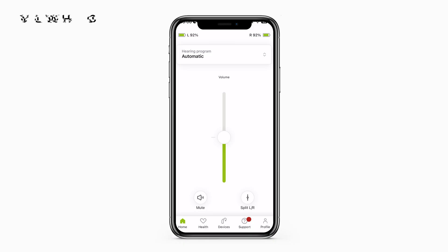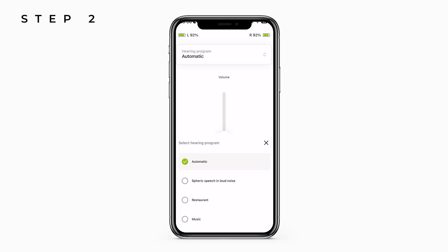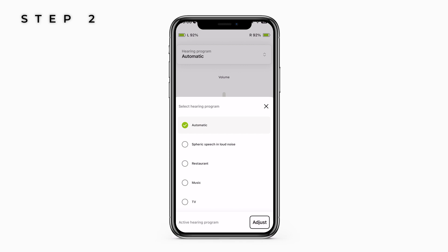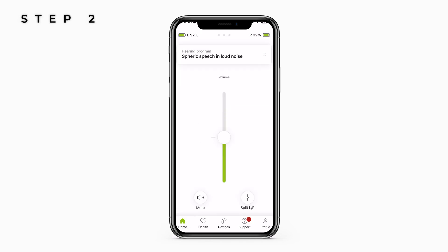Step two: head over to the My Phonak app and click on the program drop-down menu. Press spheric speech in loud noise when you're in a noisy environment, and voila — now you have forced your hearing aids onto their most effective setting for when you're in a noisy environment.